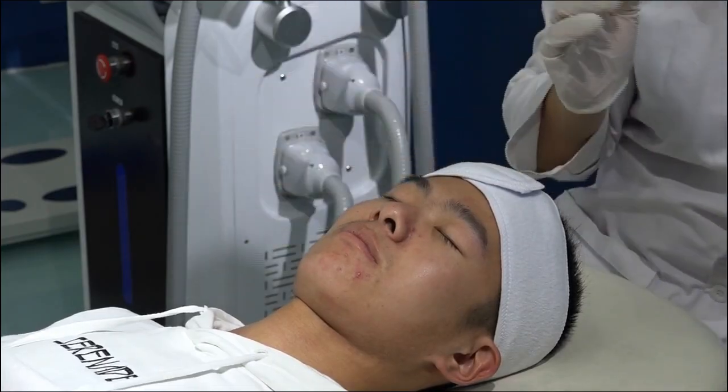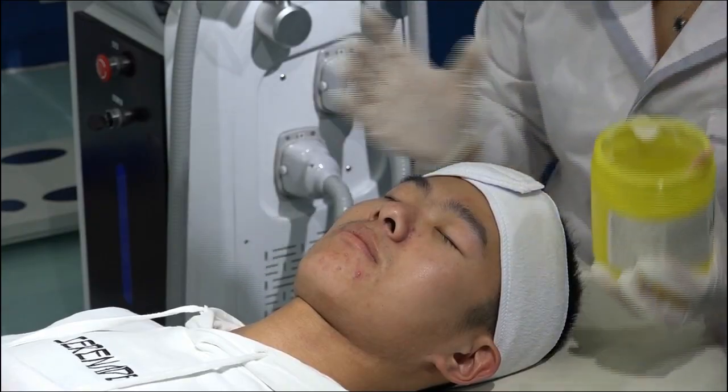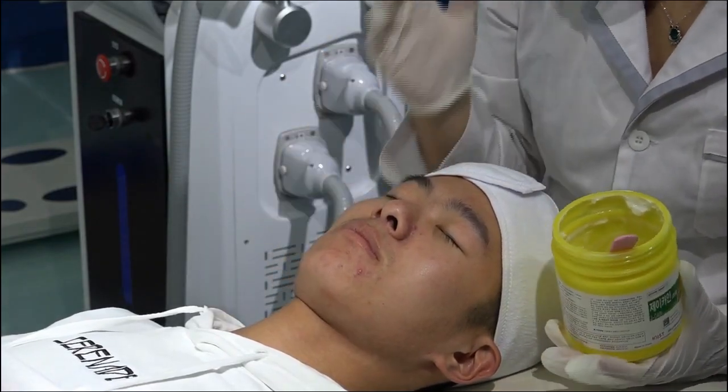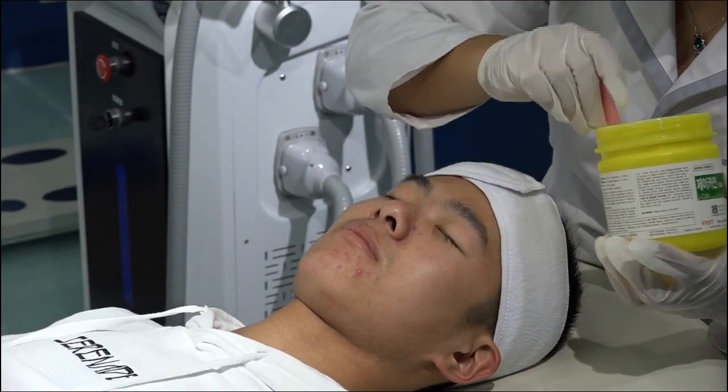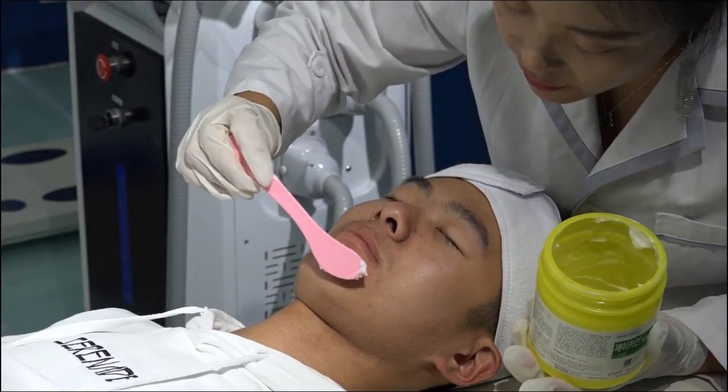And then the second step, we suggest you apply the numb cream to the treatment area. Then the clients will have no feeling, it's very comfortable. We normally apply a layer of the numb cream, like this.